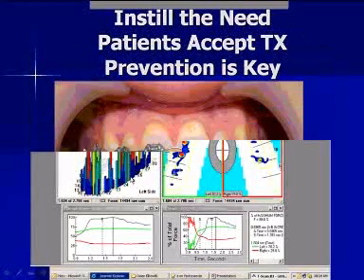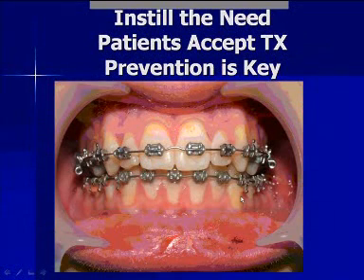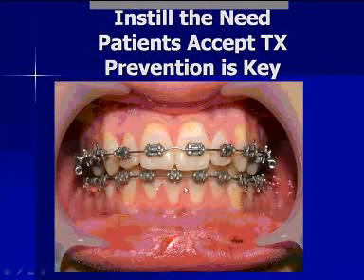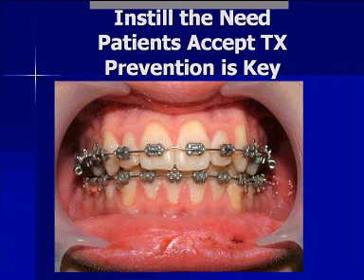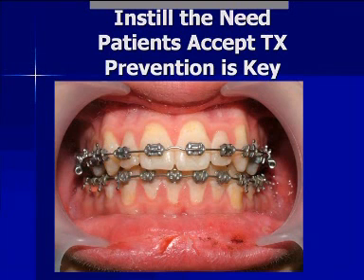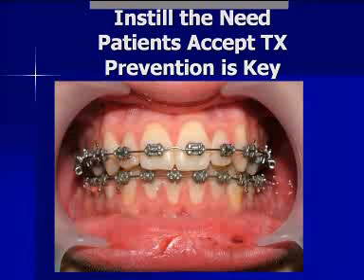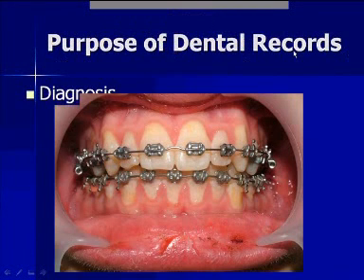So he did end up having orthodontic treatment, and you can see the recession's not going to come back, the tissue's not going to grow back, but we can certainly stop it from getting worse. Okay, so this is an example of how the TScan was used to get the parent who thought it was only cosmetic to commit to treatment. He'll have a much nicer smile out of it, obviously, but more importantly we're going to prevent the breakdown of soft and hard tissues.